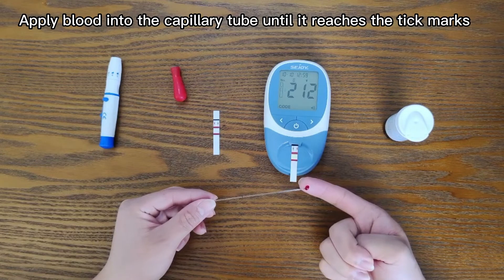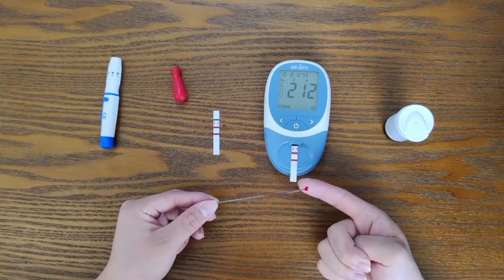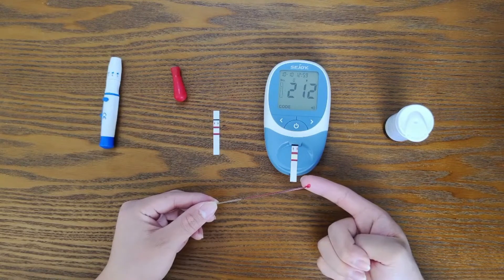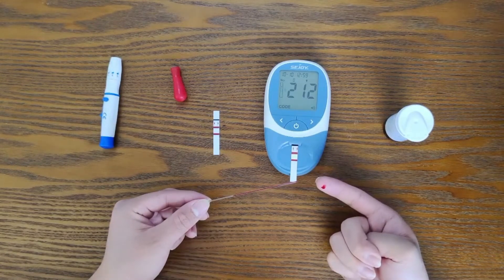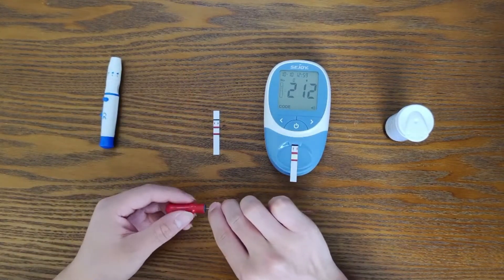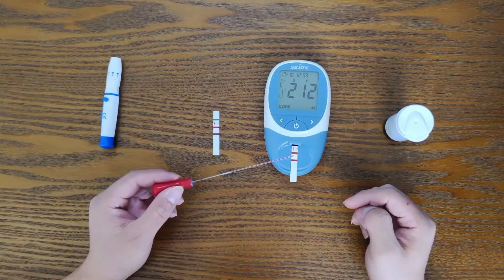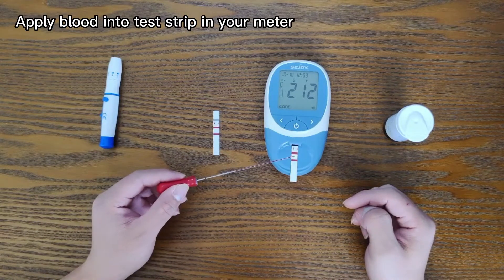Apply blood into the capillary tube until it reaches the tick mark. Then apply blood into the test strip in your meter.